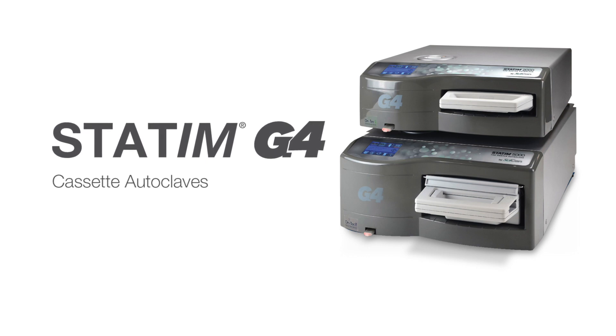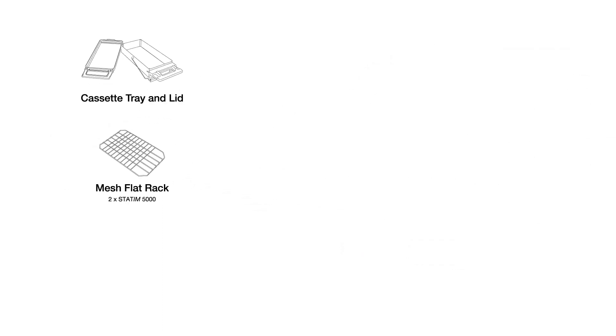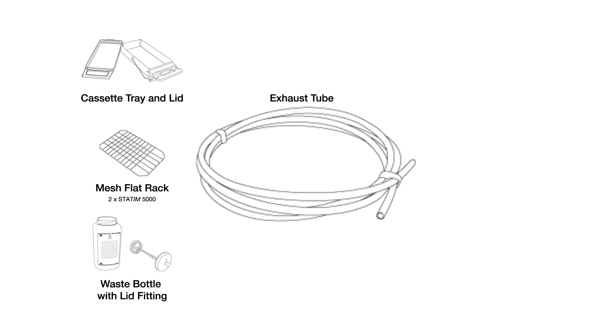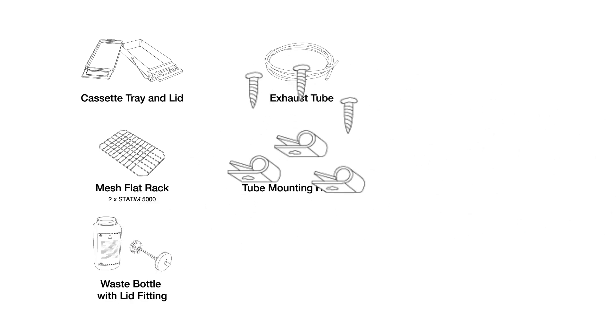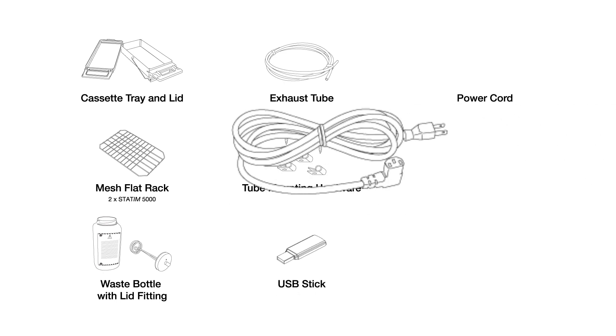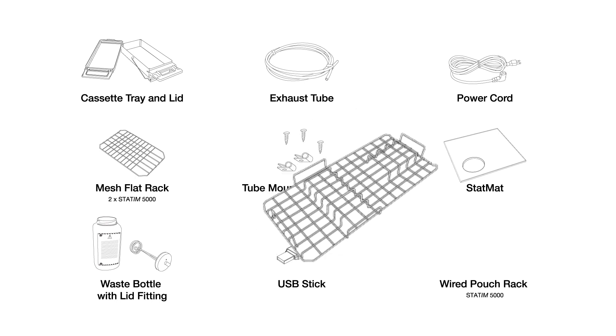Your STATUM G4 unit comes with the following items: a complete STATUM cassette with a mesh flat rack, waste bottle with lid fitting, exhaust tube, tube mounting hardware, USB memory stick, power cord, and stat mat. In addition, the STATUM 5000 G4 unit includes a wire pouch rack.